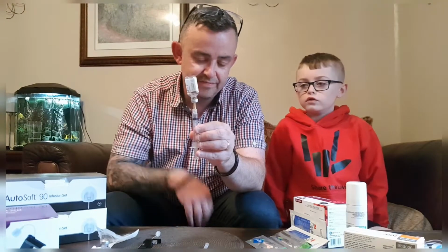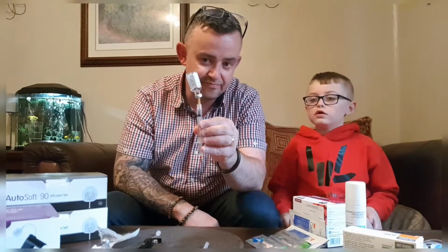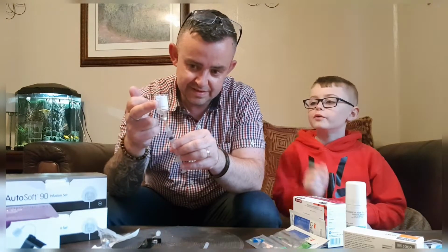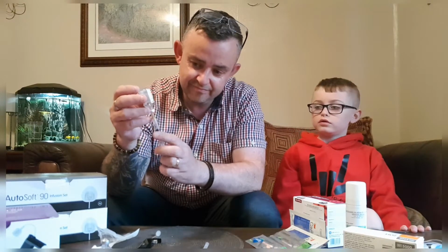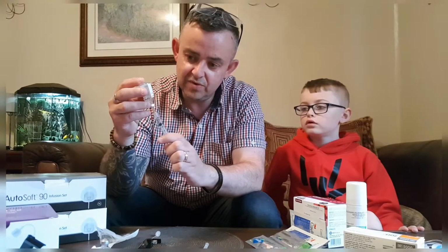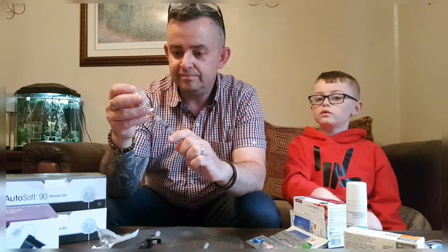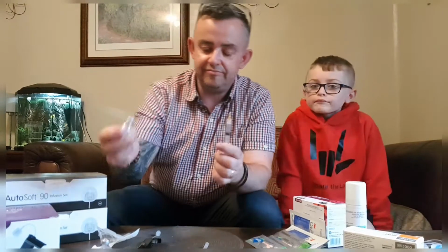Can you see the plunger drops? That's insulin. That's my insulin. It looks like it's not going in, but it is going. See how much there is. So let's pull out all we can. Liquid gold. Right, that's that one.